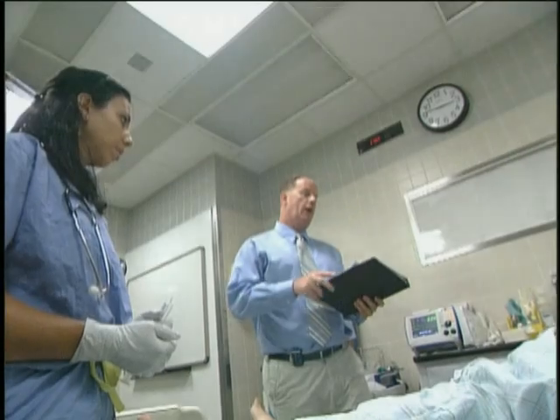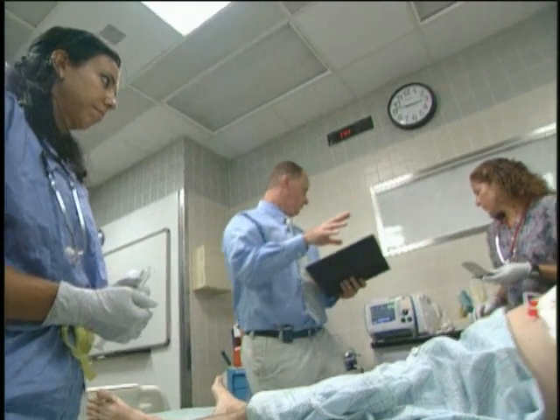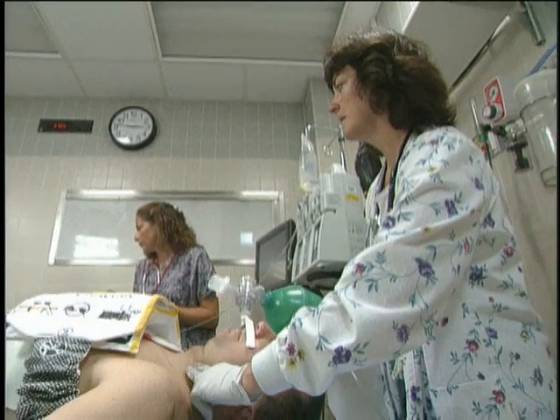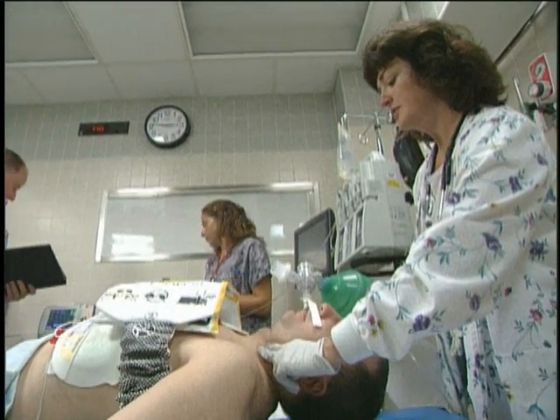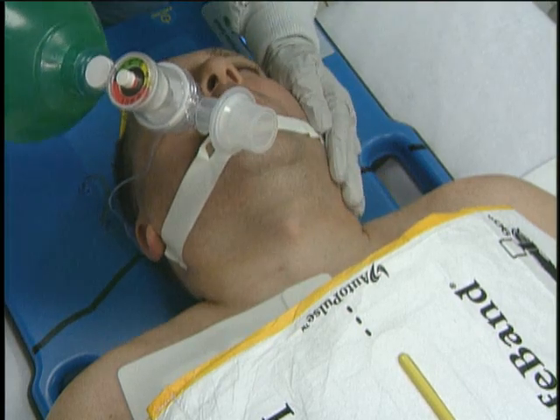Why don't we go ahead and pause the auto pulse, please. Let's feel for any blood pressure, any pulse. Rhythm looks to be sinus. Does he have a pulse with that, please? We have a strong carotid pulse. Very good. You're okay, Mr. Spinetti.